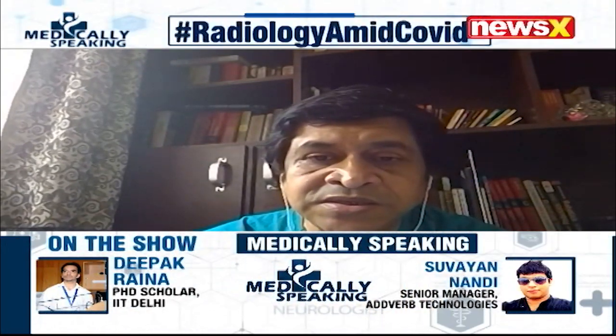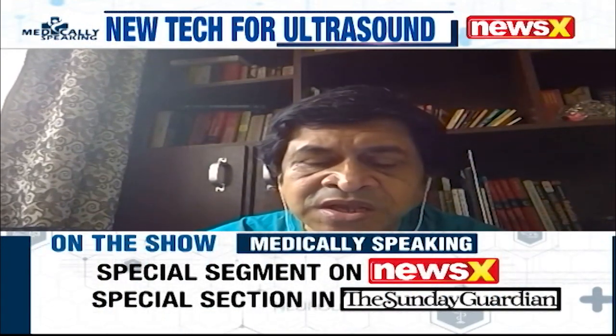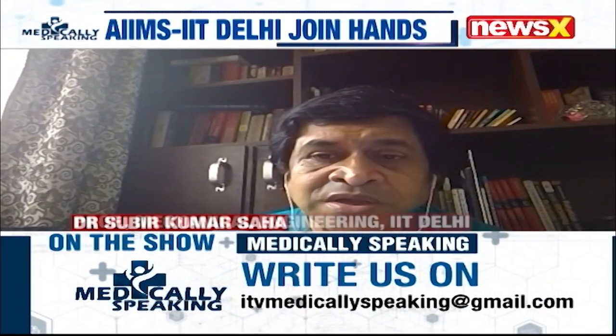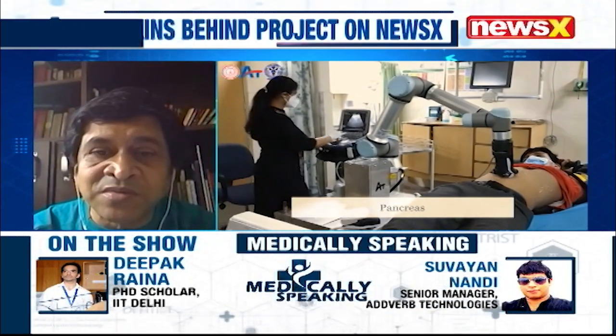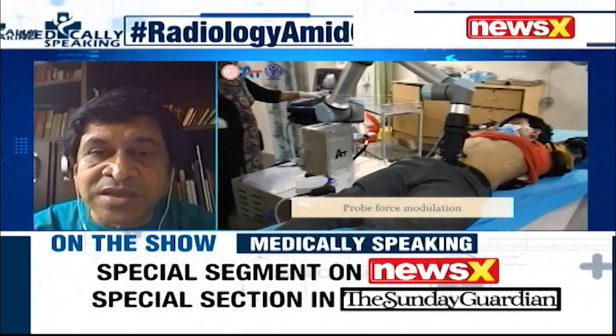And the main challenge is what has been discussed by the earlier persons, that typically a robot, if you ask it to go from A to B, it will go from A to B, what we call the position control, and it will not bother if someone comes on the way, right? But here, first thing is you are handling a human being. So if you ask it to go from one part of the stomach to another part of the stomach, it will not bother if something comes on the way, maybe your stomach is a little up or down. So it will hurt you basically. That is one aspect of it.